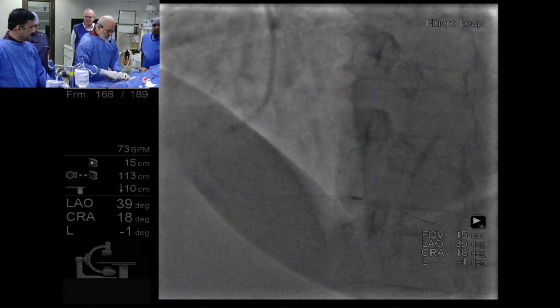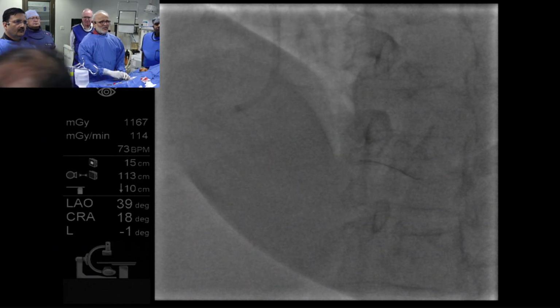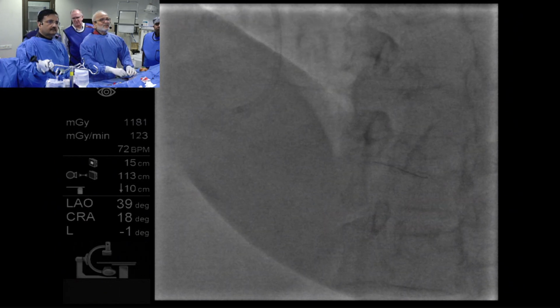Sir, Tarun here. Would you like to do IVUS in the ostium of PD now, after burying? I don't think so, Tarun. I will not really waste time doing that. Let me dilate and fix that. And that will reduce my heartburns. Fine, sir. Thank you.